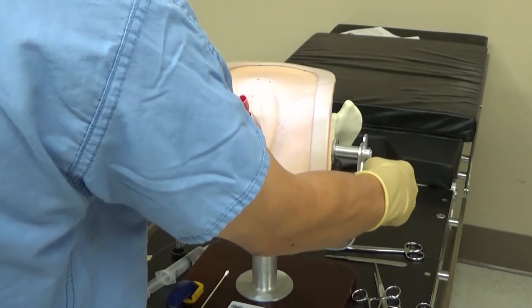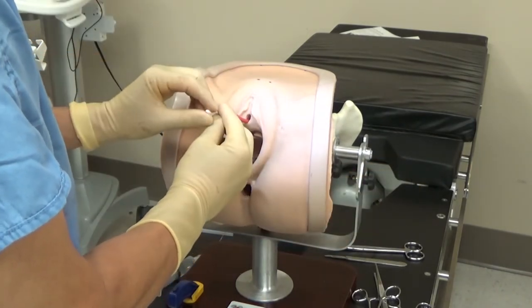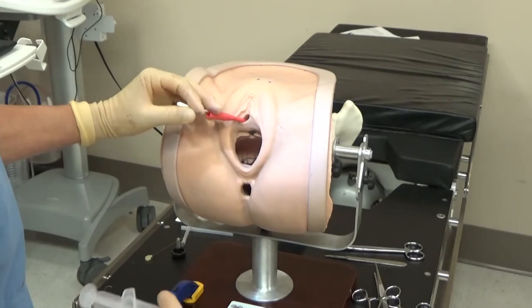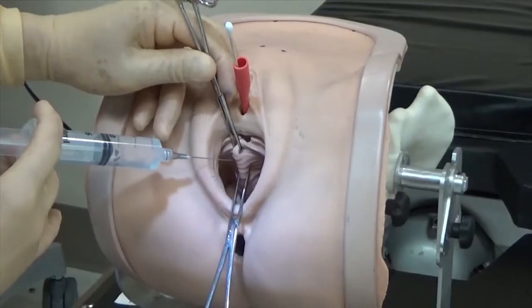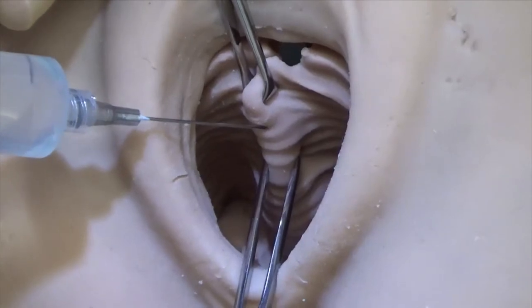in the retropubic region. I use a dilution of 100 cc's of normal saline, 20 units of Pitressin, and 20 cc's of 0.5% Marcaine, and inject 40 to 50 cc's on either side. This can be done from the bottom up or the top down. I also inject several cc's into the midurethral dissection plane.